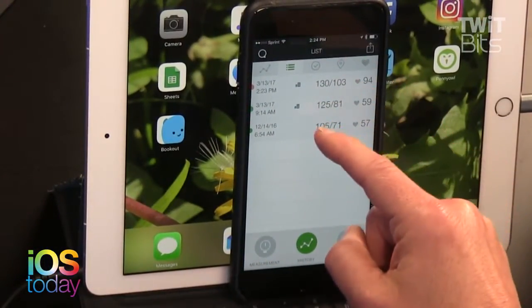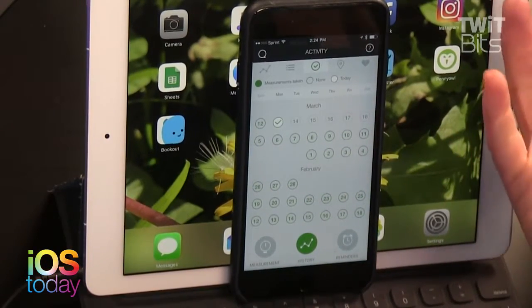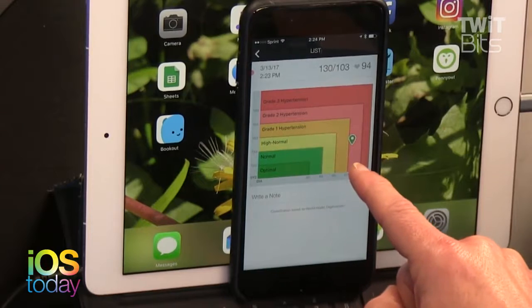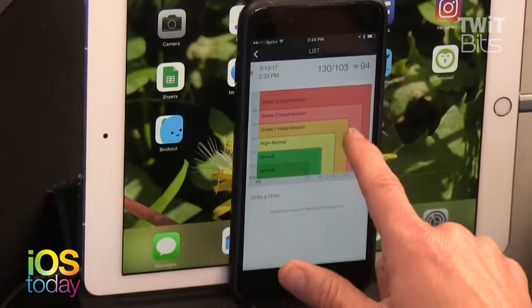The app shows history so you can track readings over time. There are reminders to take your blood pressure, and it gives detailed graphs. It flagged grade two hypertension — but one reading doesn't tell the whole story. I just had coffee and I'm doing a show, so my heart rate is elevated. The thing I like best about the Cardio Arm is how compact it is. You're not going to carry an Omron around, but this folds up nicely, and being tied to your smartphone gives you an automatic journal of readings.